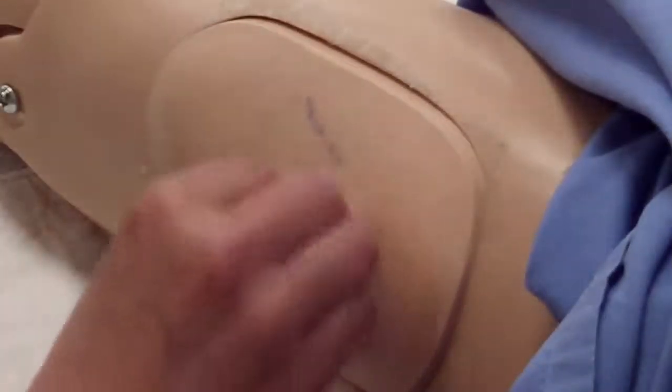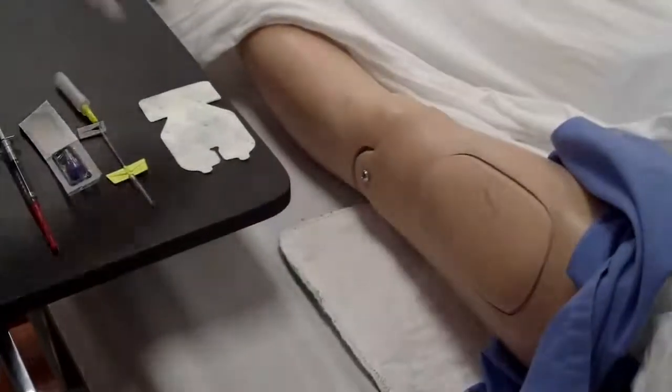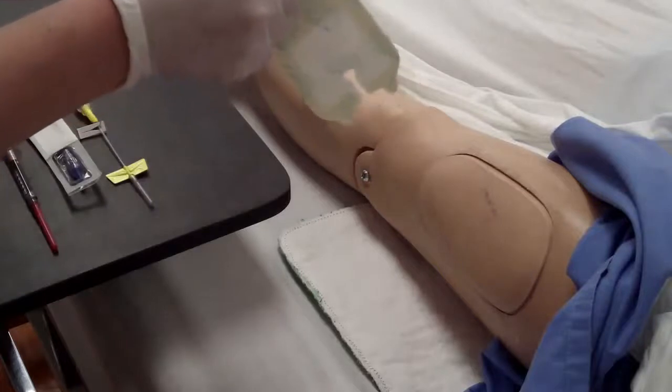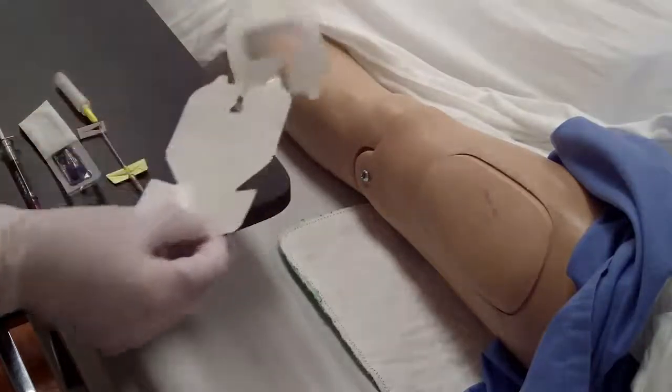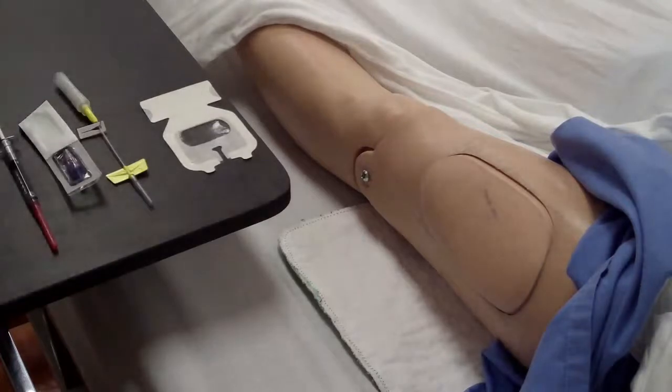When you have determined the best location for the subcutaneous butterfly, ensure that you give the area a good clean with alcohol and allow to dry. While the alcohol is drying, ensure that you do some hand hygiene and don some gloves. You can start by removing the backing to the dressing.